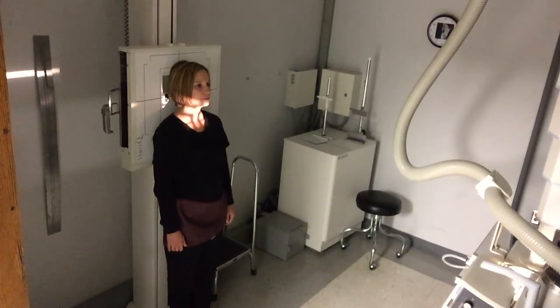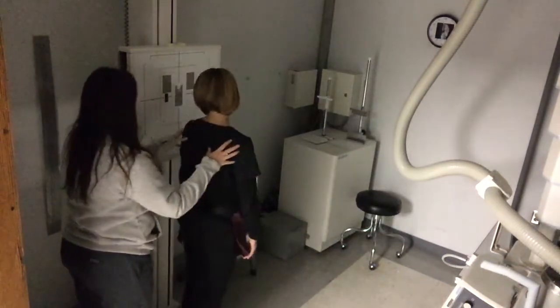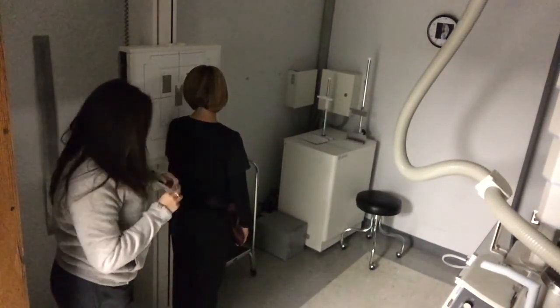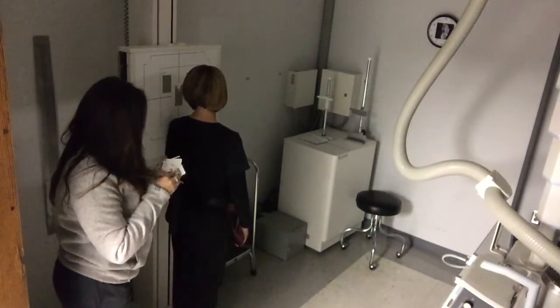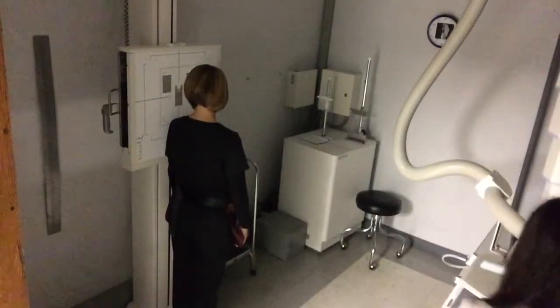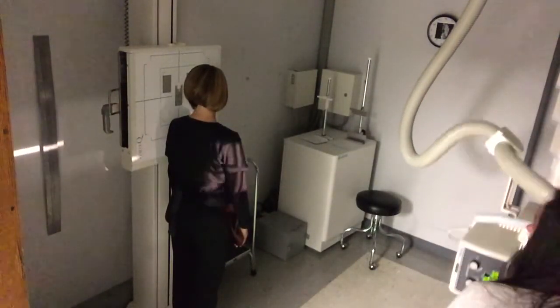expose. And the last projection is a lateral, so I'm going to have her turn to the left with her left shoulder up against the board. Now this time I have to use my left marker, so I'm going to take this right one off before I forget. Also, I'm going to take the angle off of my tube, and we'll be horizontal. We're staying at 72 SID.